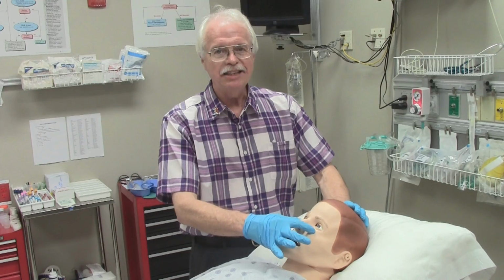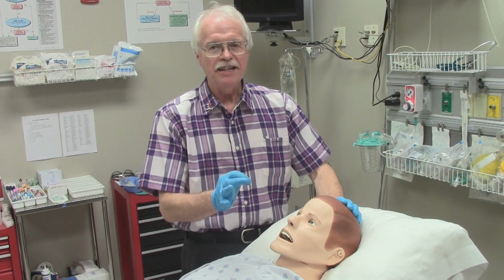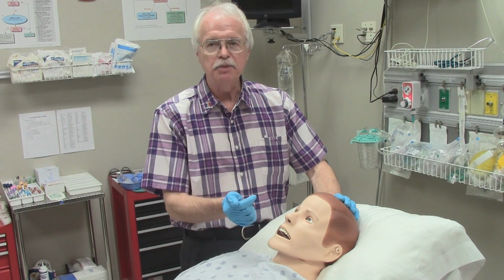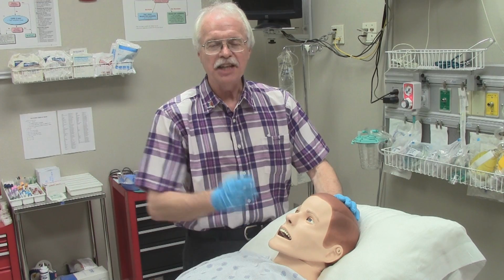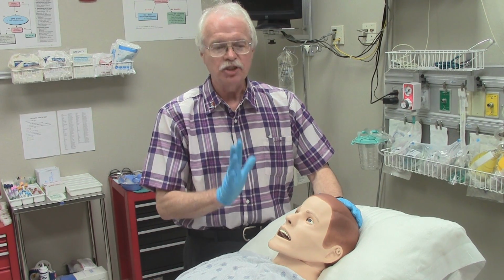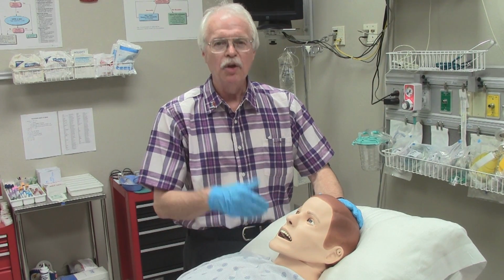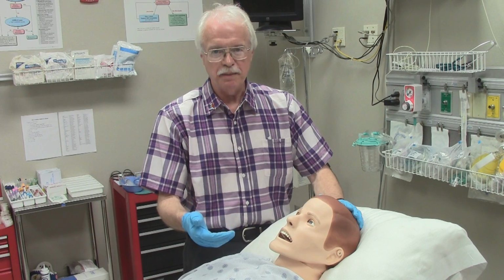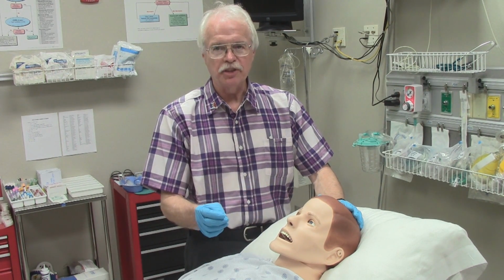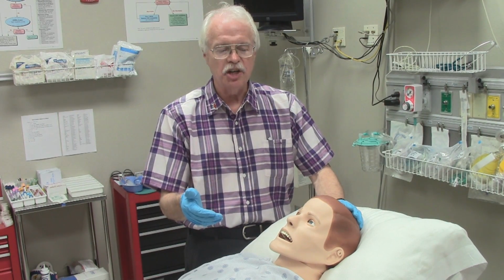The SimMan Essential has pupils that can be varied in size by changing out a pupil and iris insert that clips into the mannequin. That is a one-time change that can be made at the beginning of the scenario. The instructor cannot vary the pupil size from the control room once the scenario has begun. So you can check pupils initially during your exam of the patient, but don't expect them to change in size as the scenario progresses.